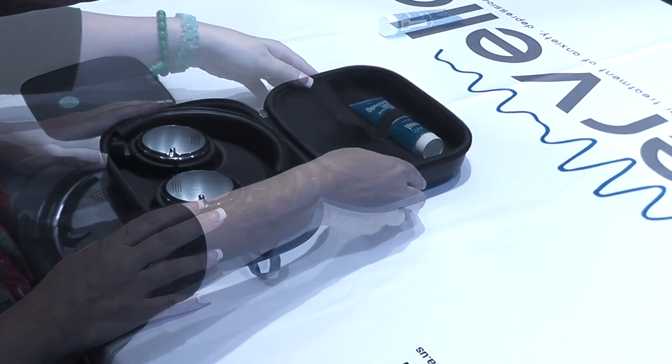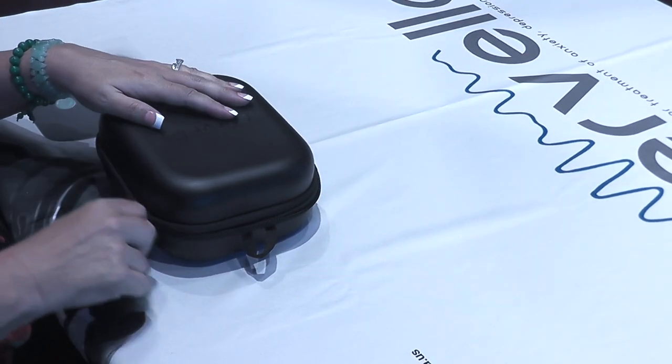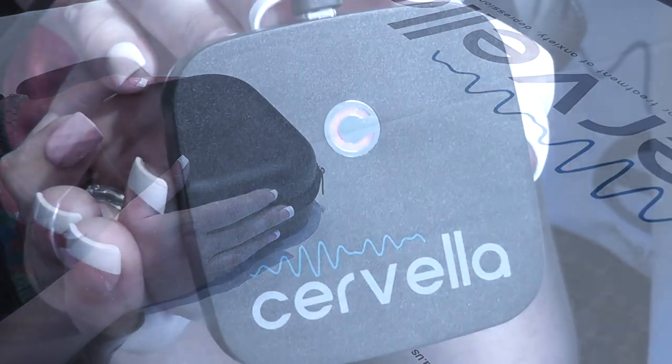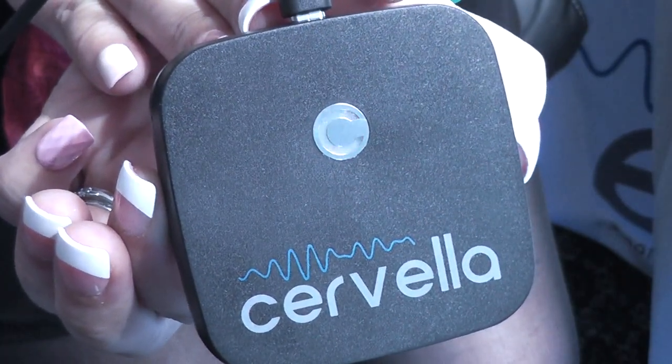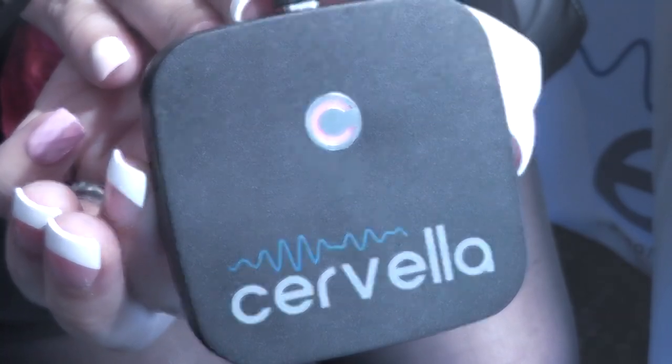When not in use, store your Cervella device and its accessories in the included protective carrying case. Charge both the Cervella device and the stereo headset fully before the first and each subsequent use.